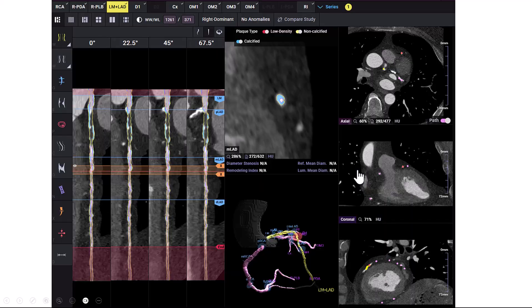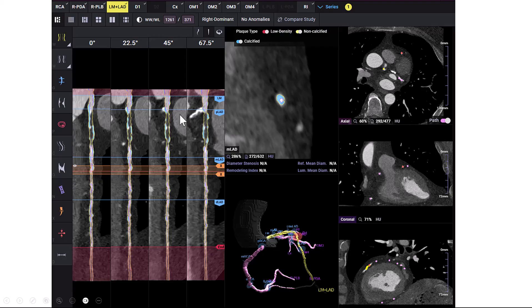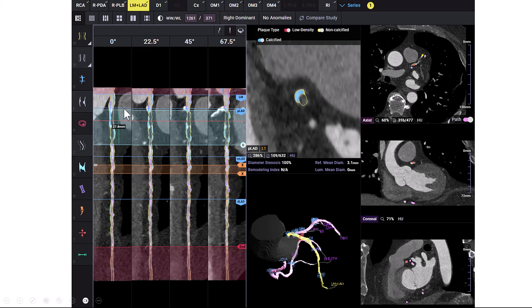He was therefore referred for coronary re-canalization, and as part of the planning, we obtained a coronary CT angiogram. This is the AI-QCT analysis of the coronary CT — the straight MPR, or multi-planar reconstructions. What we're seeing here is a CTO of the proximal LAD with lack of contrast within the occlusion segment. The automatic detection of the CTO is highlighted.